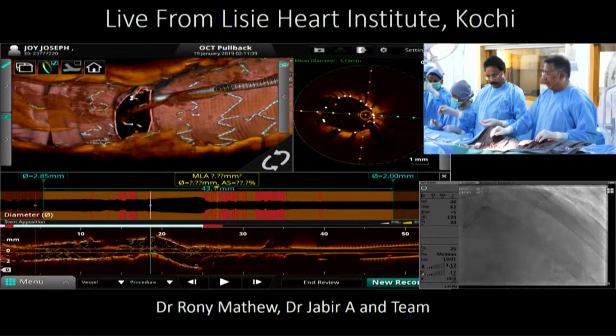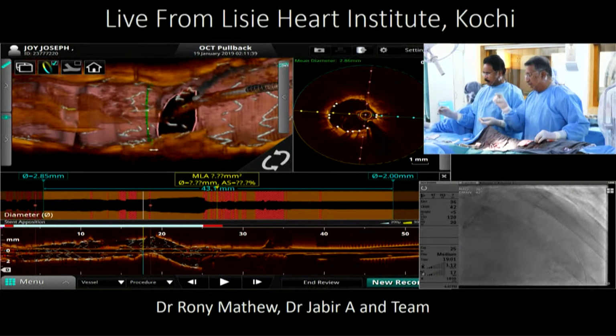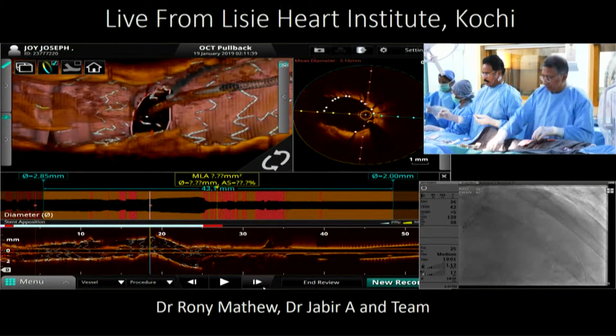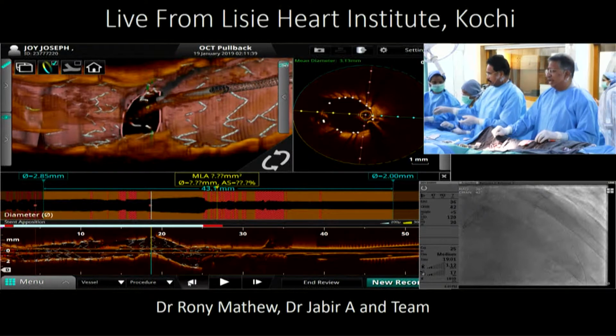What I think is that, in the sense, there is a crown and a valley. So the wire has gone in through a distal strut, but it is limited by the valley, and that is why it is not otherwise. Otherwise, the wire would have laid on the proximal part of the side branch. So I think it's a distal cross. 2.75, please. So I'm going to do a kiss.